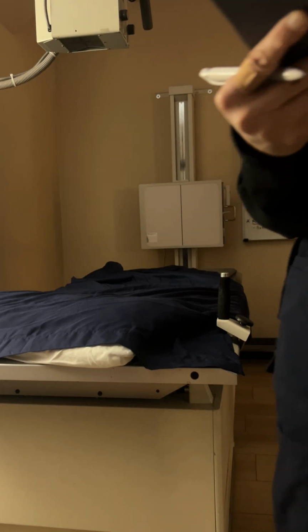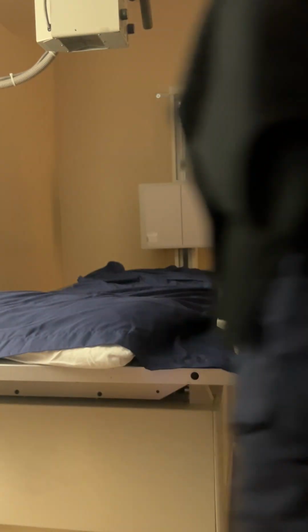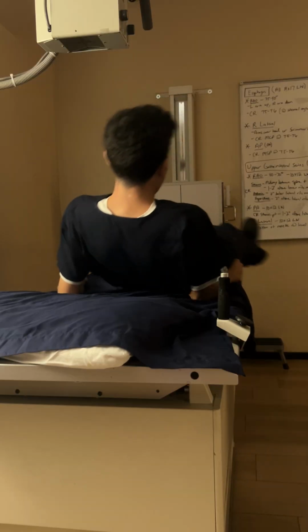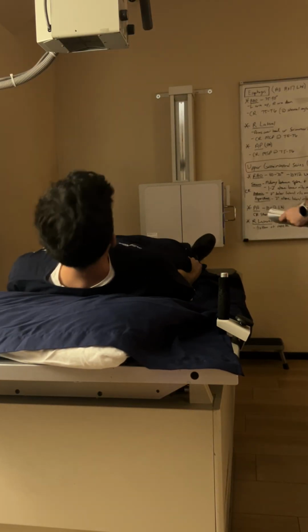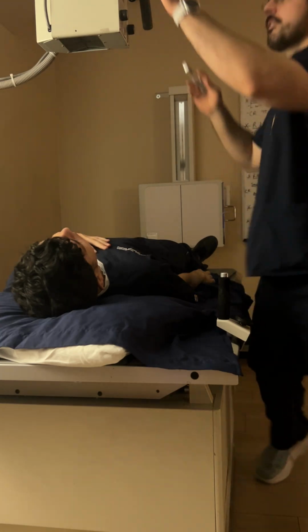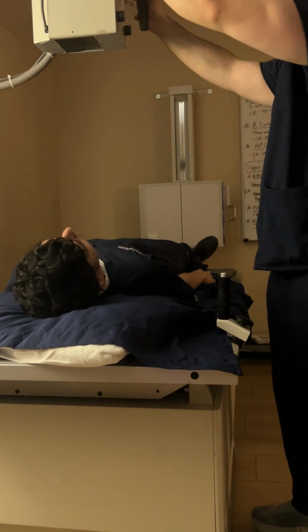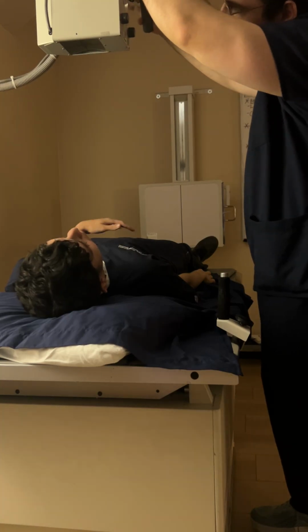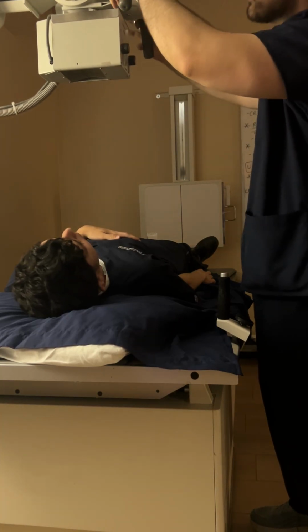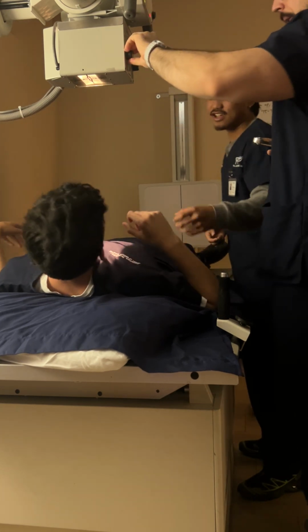Didn't even put my marker anywhere. That's what I forgot. Just out of the field to the edge. Okay. Just like it's fine how we put it on the corner. So for the esophagus, I would say it matters less. You just want to make sure that it's marked correctly. So if you're putting your marker like for the RAO, you can put right or left marker, just make sure it's marked correctly. Okay.